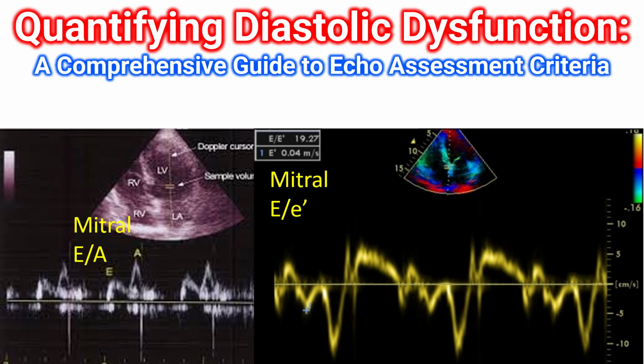Quantifying diastolic dysfunction by echocardiography is essential for identifying heart failure with preserved ejection fraction. The clinical standard is based on the 2016 ASE/EACVI guidelines, though emerging research in 2025-26 emphasizes the integration of left atrial strain for higher sensitivity.